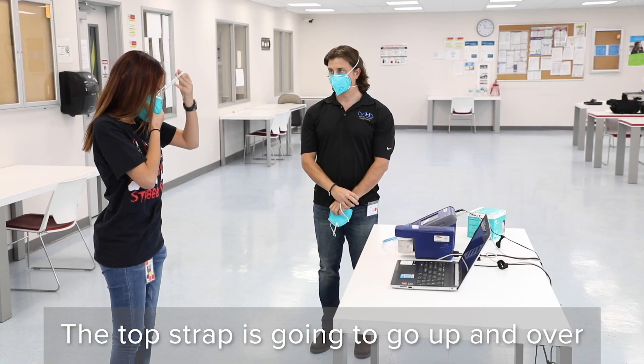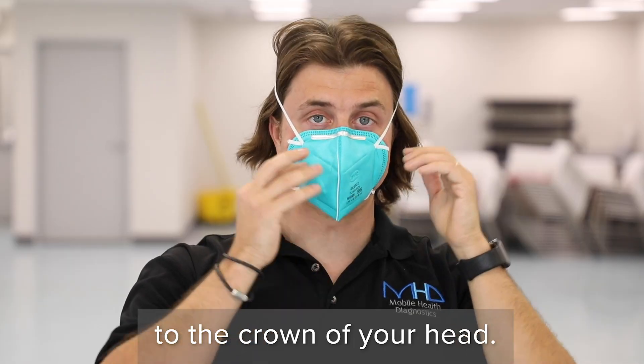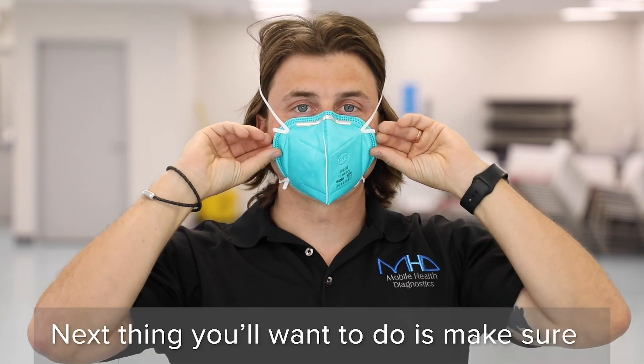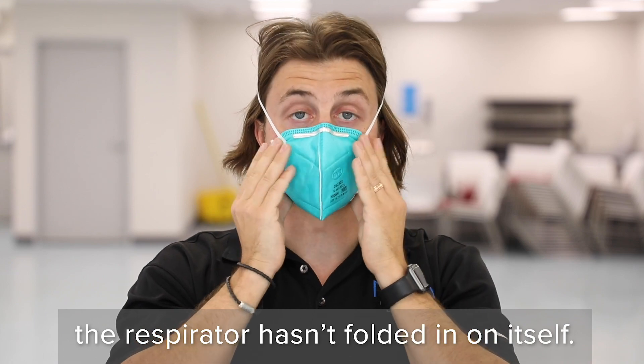The top strap is going to go up and over to the crown of your head. Make sure it's on the crown of your head — not too far back. Also make sure that the respirator hasn't folded in on itself underneath.